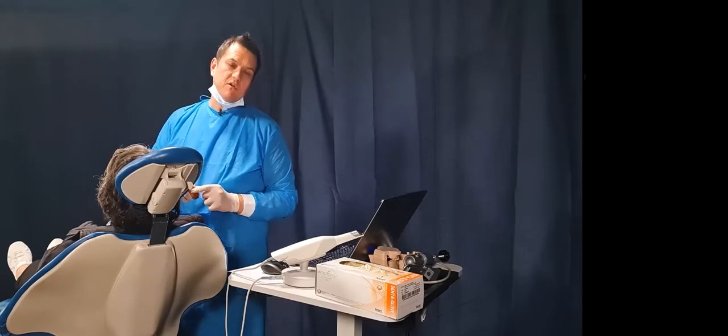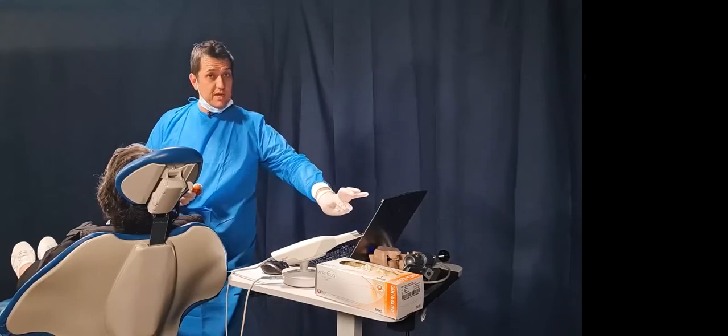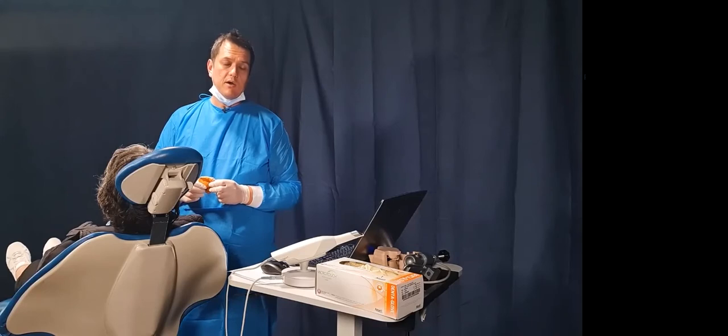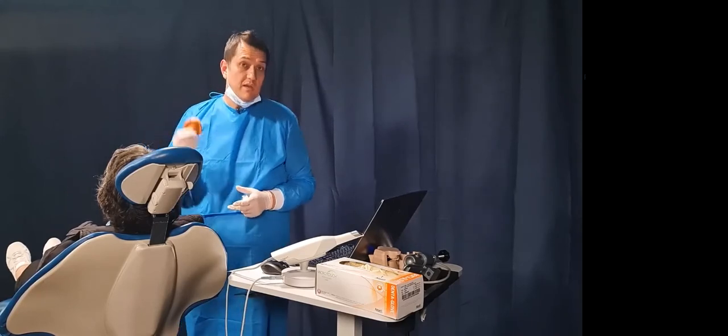And that's the benefit of the reference technique. So you will reduce your appointments. Whereas with the edentulous, like we just had just now, you will find that you will still need to have that MMR appointment. But irrespective, it's a very good impression technique. Let's have a look now how we do this.